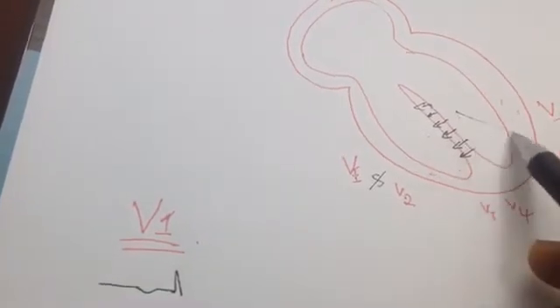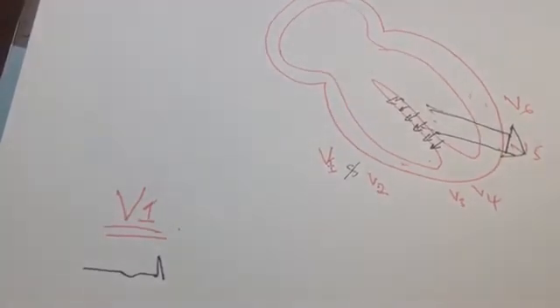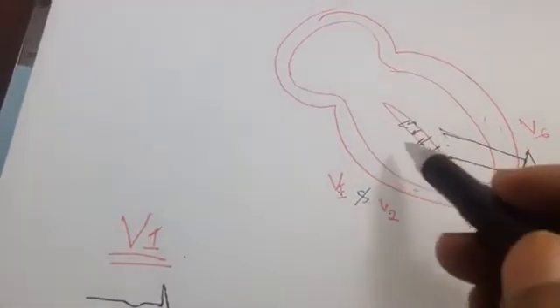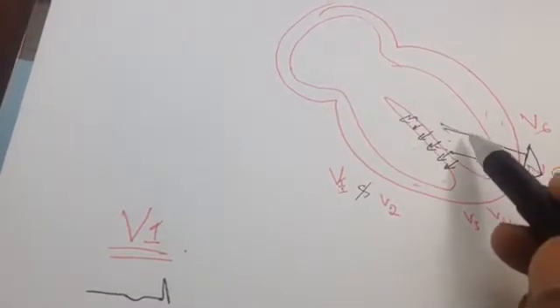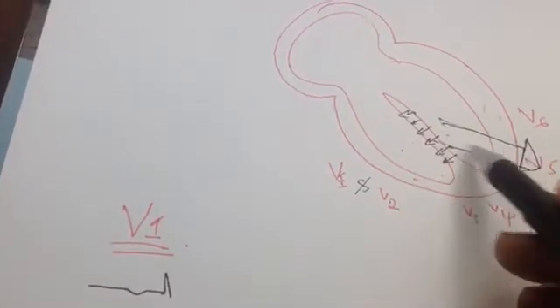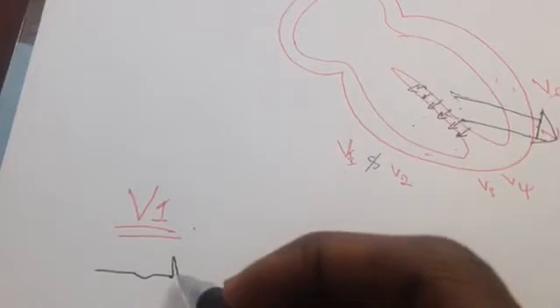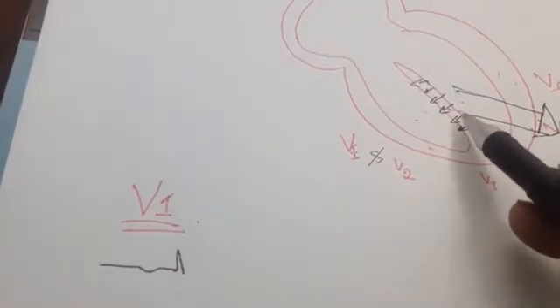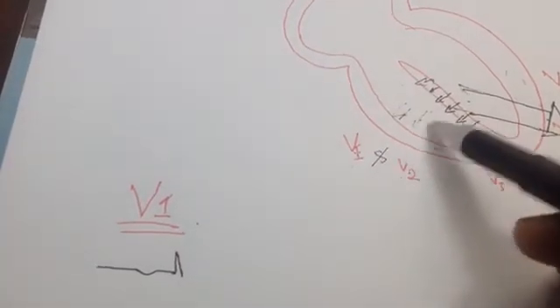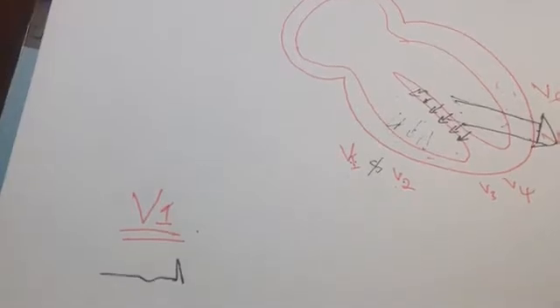As we have said, the left ventricle determines the direction of the depolarization wave because it receives the strongest electrical activity, being very thick. So the impulse direction will outweigh the one on the right side. That is why in V1 and V2 the impulse goes away from V1 and V2. Also, the impulses are going toward the right ventricle, but since the left is thicker, it determines what the ECG lead will show.